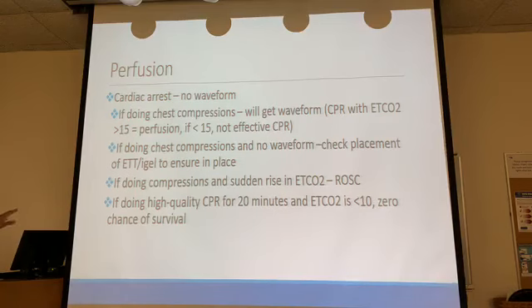If you're doing chest compressions and your end-tidal CO2 is 5, you need to push harder, push faster, or you need to get somebody else to do the chest compressions. If it's less than 15, you're not doing it right. You need to get hard. And it's another way to keep track of, okay, is this person starting to get tired? You get a guy down there doing chest compressions and they're starting off with an end-tidal CO2 of 18, 20, 25, great.